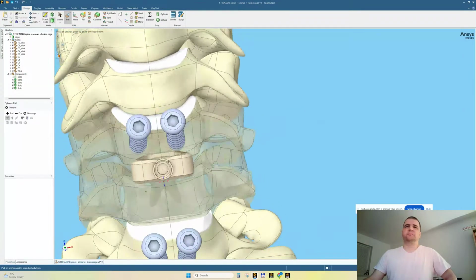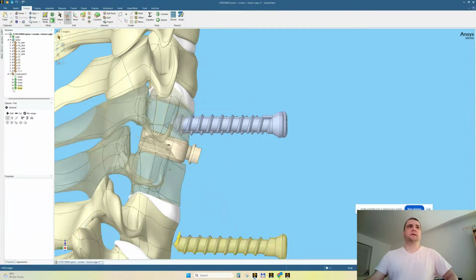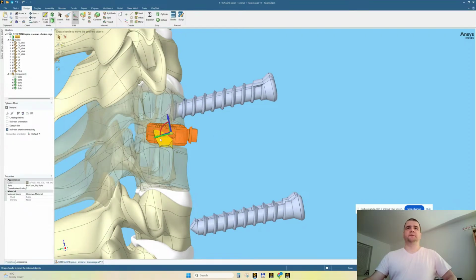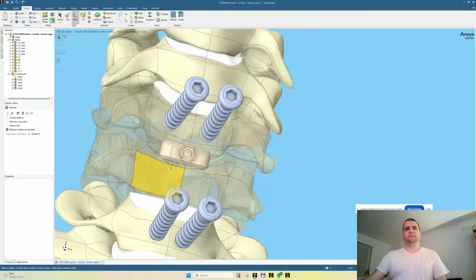Scale this again. We are going to choose a point in a middle, if we can talk about a middle. I would like this cage to keep its references, and I'm selecting the 3D model. I said 0.9. Is it enough? I think it's not enough. It should be even smaller. Scale 0.9 again, and we're going to move it here and here. I will make the vertebrae opaque again because they are transparent and it's hard to understand what I'm doing here. Not only for you, also for me.